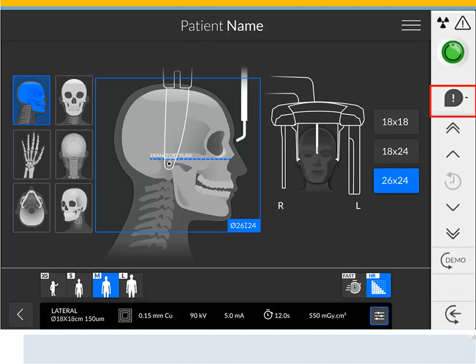Accessory Notification will appear on the interface if the correct positioning accessory does not correspond to an acquisition. It turns blue if the positioning accessory is not removed and the temple supports are not rotated horizontally. Ready Indicator: Black indicates the unit is not ready to start acquisition; Orange indicates the unit is preparing for acquisition; Green indicates the unit is ready to start acquisition.